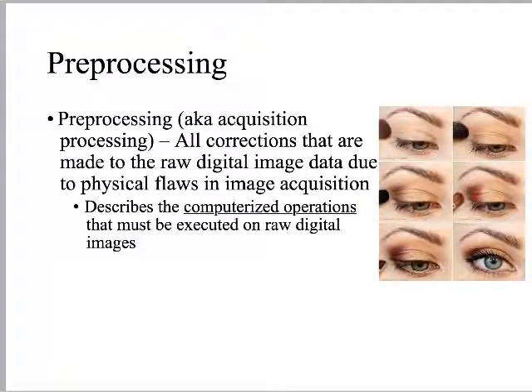The exact same thing is happening from the computer's point of view prior to its displaying our X-ray or portal film images. It's applying a whole lot of stuff to these pictures, and the processes that it applies to the pictures are remarkably similar to the processes that we apply when we do this kind of heavy makeup type stuff, right?